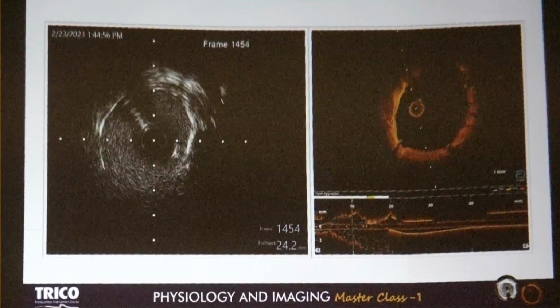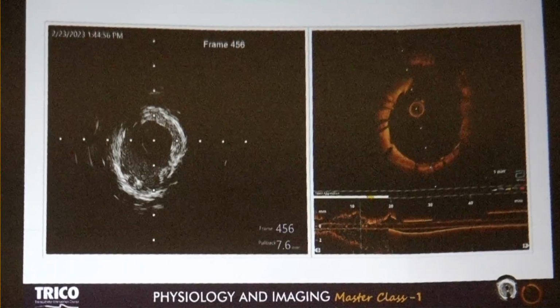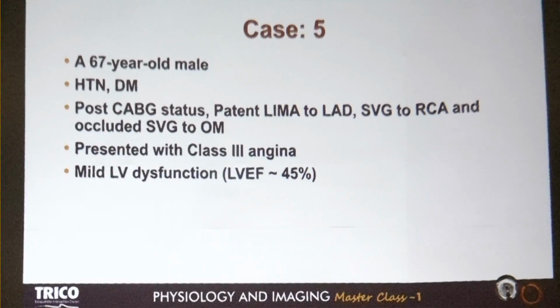Restenosis or sudden death or whatever. So we accepted that. The patient is doing fine for the last 1.5 years. These are the patients we keep on close follow-up, and I am going to do a check angiogram, maybe next month for this patient, and we will evaluate with even an OCT IVUS run.